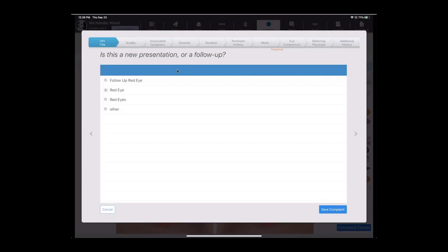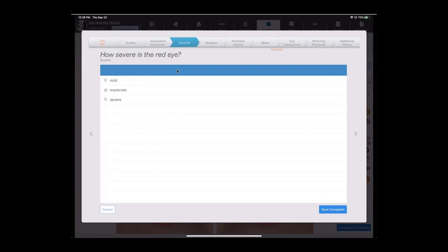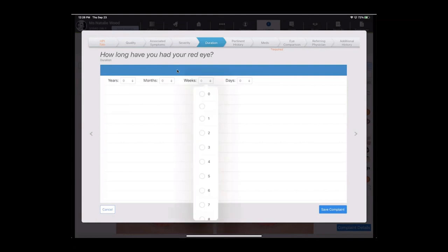So today, we'll do a new presentation of a red eye. The quality today is irritated, new, and painful. It is moderate in severity, and Natalie tells us it's been going on for the last three weeks.